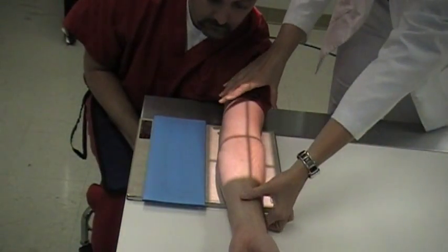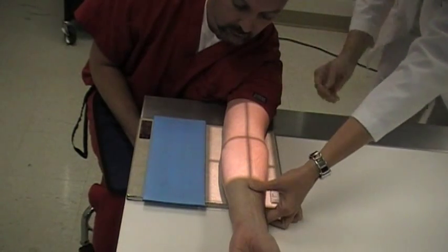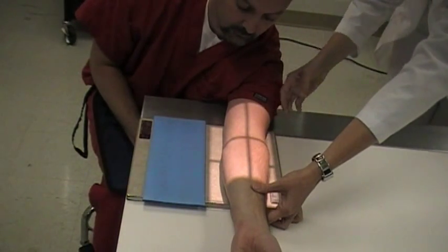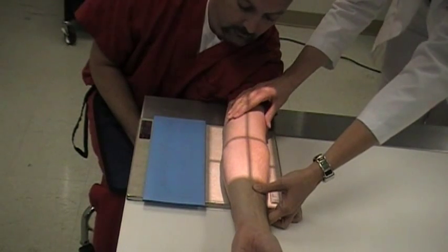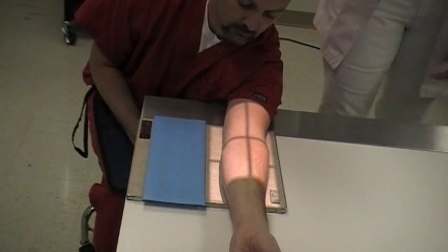So have the patient's arms straight out, hand supinated. Make sure that the humerus is down touching the cassette. And then your central ray is going to enter right at the bend of the elbow.